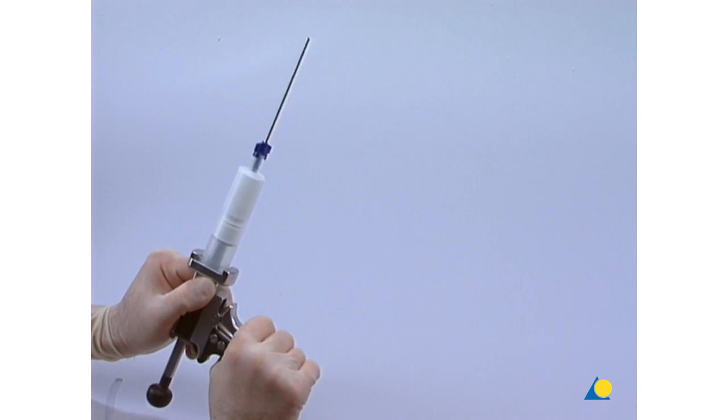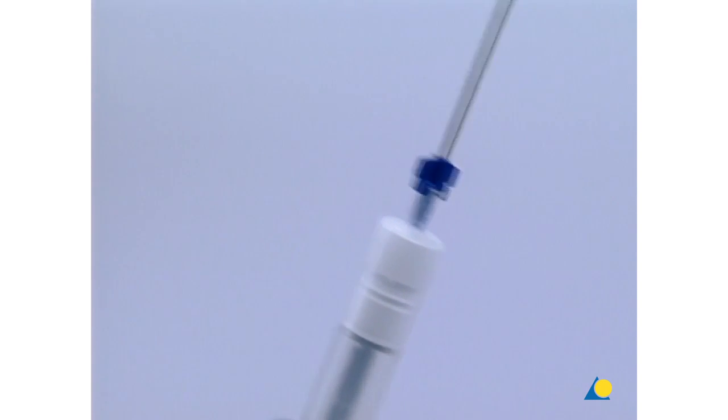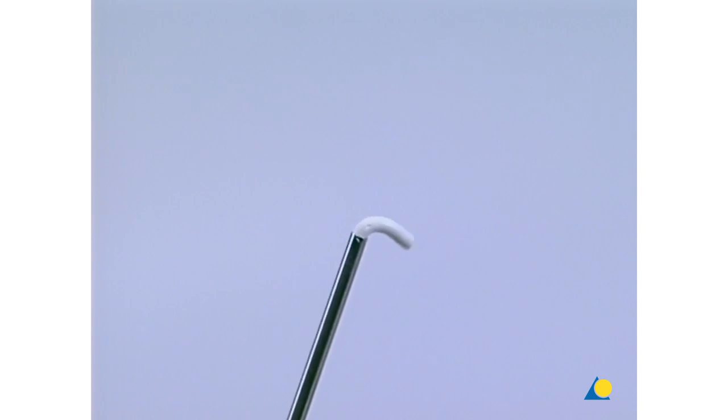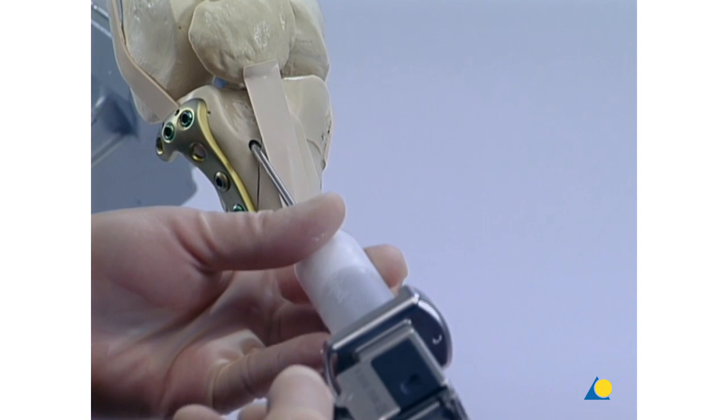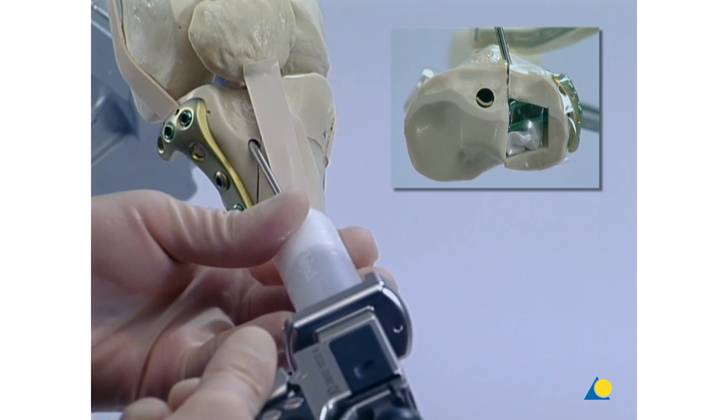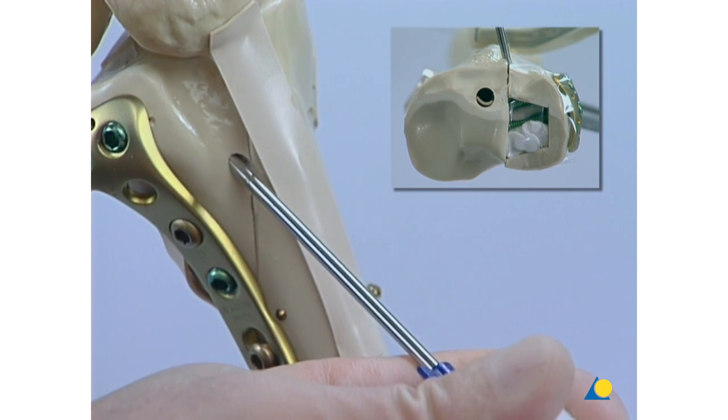When the delivery gun is held upright, the remaining air is expelled from the cartridge by gently squeezing the trigger several times. The cannula is inserted into the defect and the defect is filled by squeezing the trigger slowly and steadily. Excessive pressure is avoided.